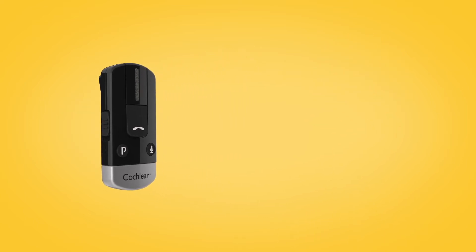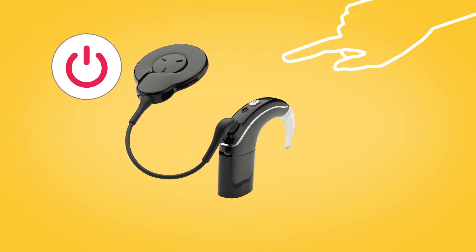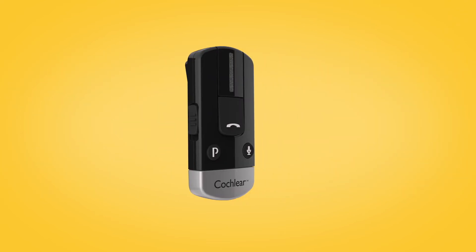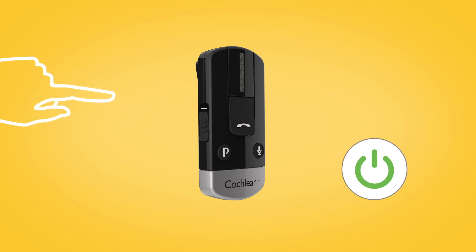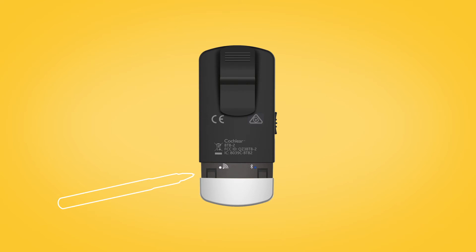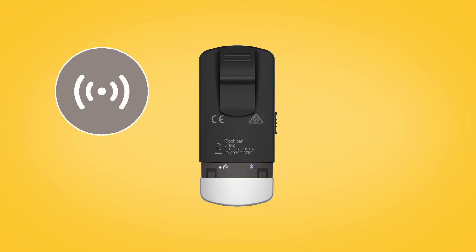To pair your phone clip with your Nucleus 7 sound processor, remove and turn off your sound processor. Then switch on your phone clip by sliding down the on-off button. Remove the silver cap and use the tip of a pen or similar object to press the white pairing button on the back. The LED on top of the phone clip will flash yellow every two seconds, indicating that it is in pairing mode.